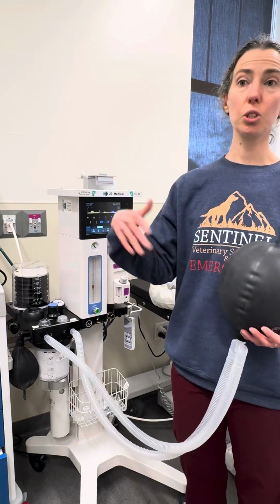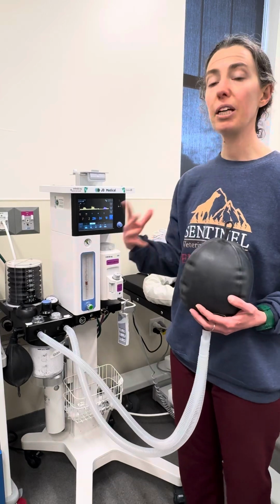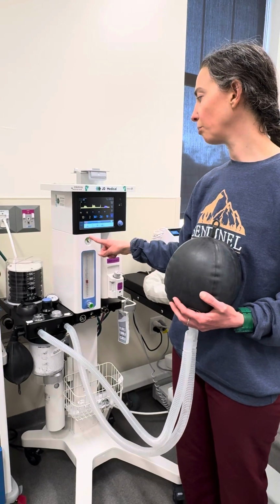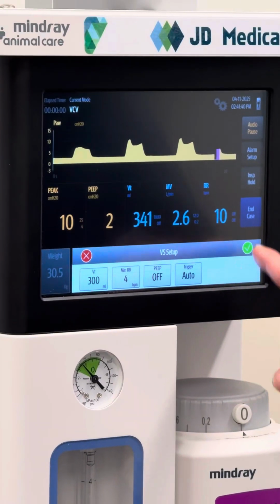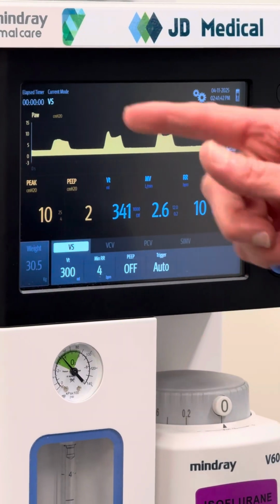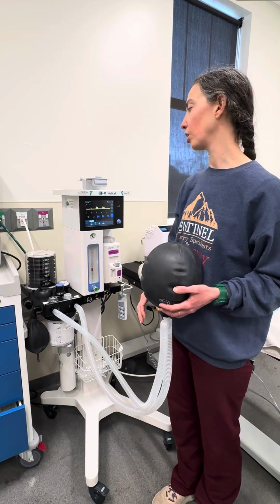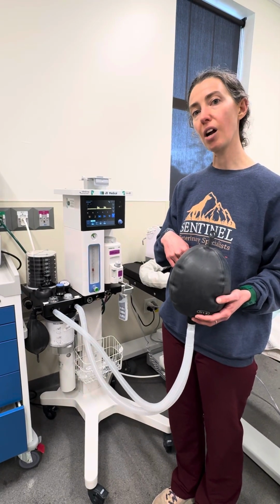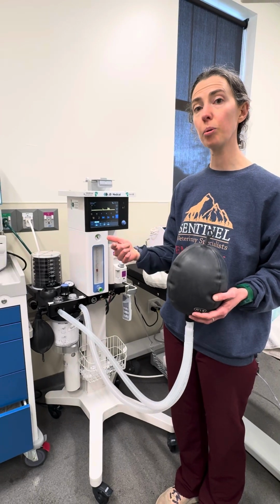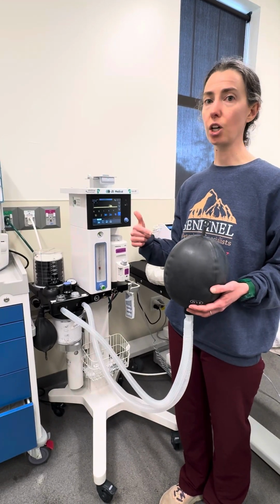So now the surgeon's done doing surgery, they're closing. That can be a good time where you switch ventilation modes and you put them on VS, which is volume support ventilation. And this is a good way to wean them off of volume control ventilation. So with volume support ventilation, now you're going to give the dog an opportunity to breathe on their own. And if they need help, then this machine is going to kick in and help that dog breathe.